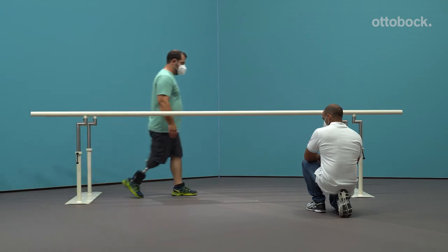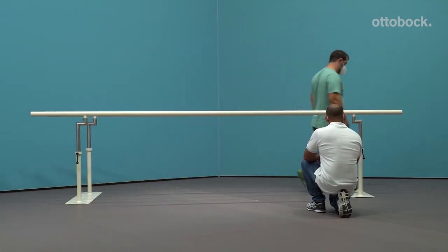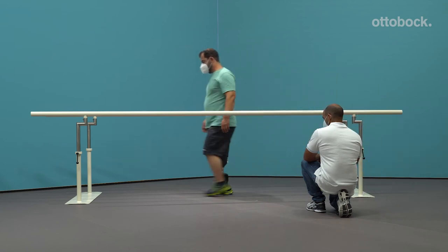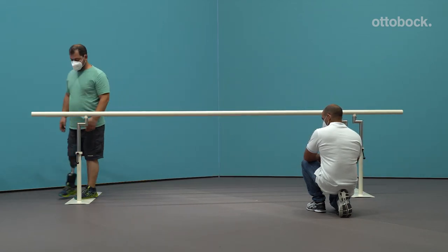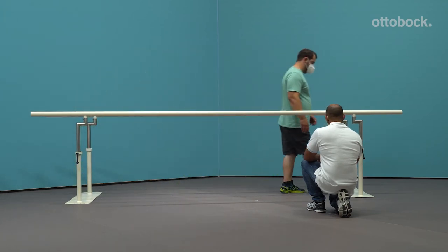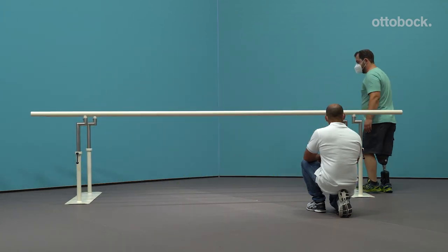Is there insufficient knee flexion during load transfer? If yes, move the prosthetic foot in the posterior direction and/or use a firmer heel wedge. The powered push-off in late stance will be triggered later as well as diminished.